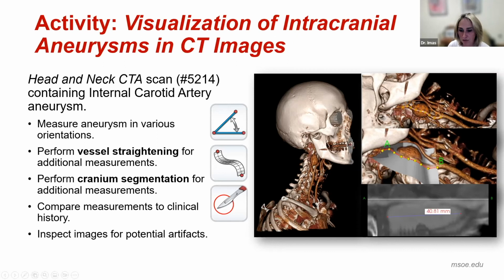The reason I selected this is because it's a standard tool that's used in radiology. Clinical systems have that tool, and it allows measurements of the vessel lumen, especially when you're looking at stenosis and things like that. Maybe not necessarily with aneurysms, but certainly when you're looking at stenosis, and it becomes really useful in that context. So it's a real tool. It's used by radiologists. It's something that you need to understand.